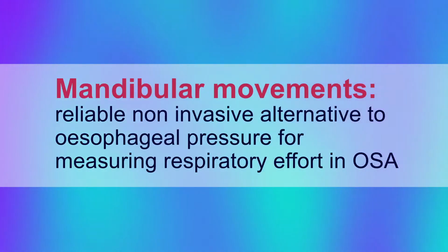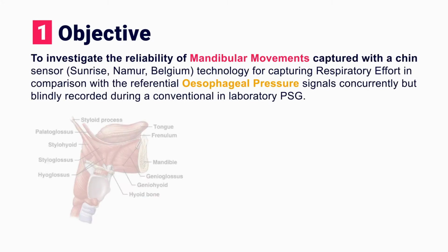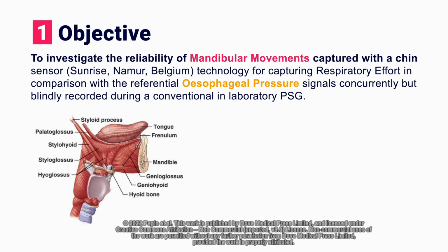This study brings evidence that mandibular movements are a reliable, non-invasive alternative to esophageal pressure for measuring respiratory effort in obstructive sleep apnea. Differentiating obstructive and central sleep-disordered breathing is highly recommended.